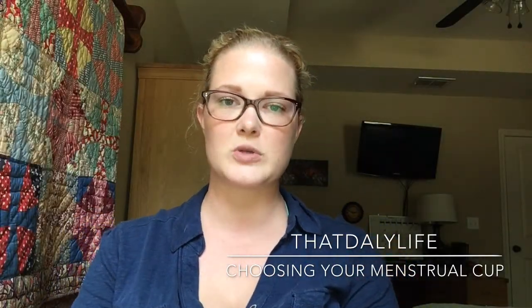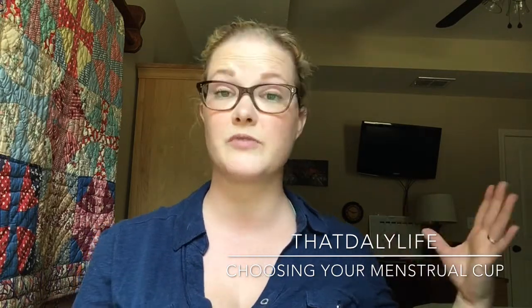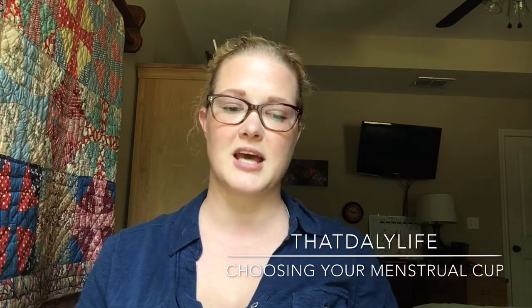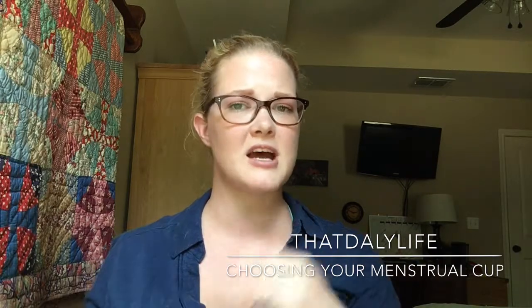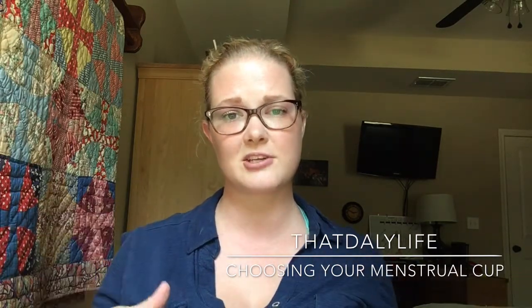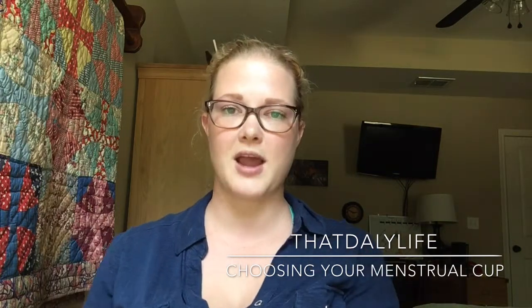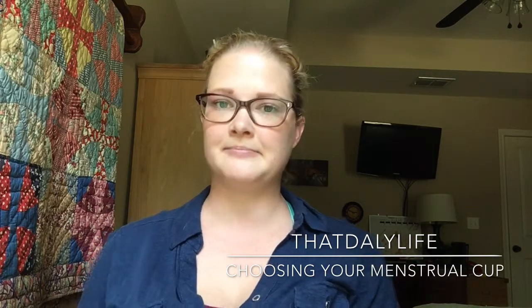I originally chose the Lunette cup because it had really great reviews online. I had seen several YouTube videos where people were recommending it, and I went with a larger size because I'm over the age of 25. I have 2 kids, which although I did not deliver them vaginally, I delivered them via C-section. I really didn't have a choice. That's why I chose this menstrual cup size.